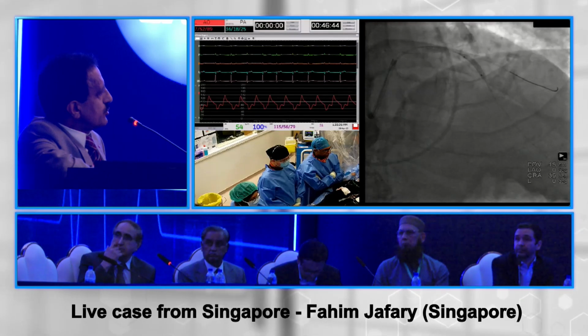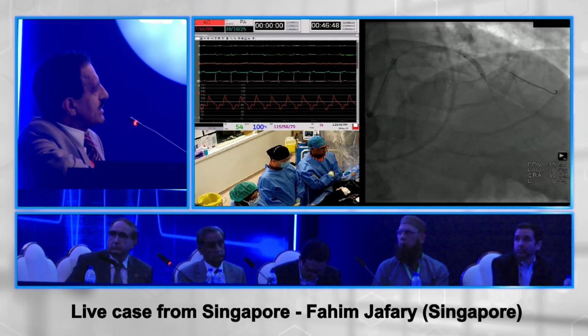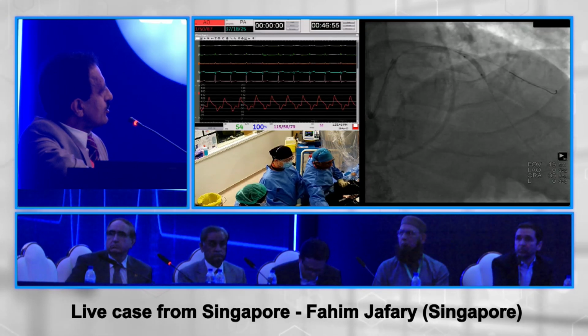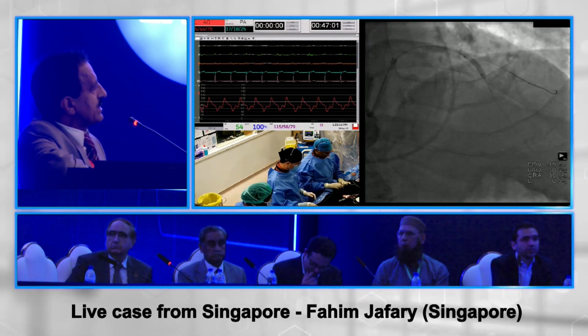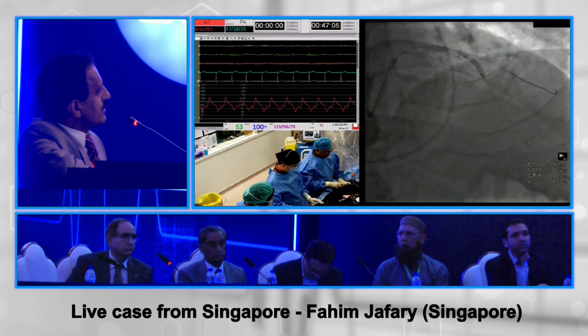Let's get comments from Ashok. Ashok, I don't know if you have seen the IVUS. So at this point, would you consider doing anything else, IVUS, or go to a non-compliant balloon, or would you have chosen IVUS, or rotational atherectomy, or IVL right from the beginning in this case? Hello, Bashir. I hope you can hear me. Yes, we can hear you.